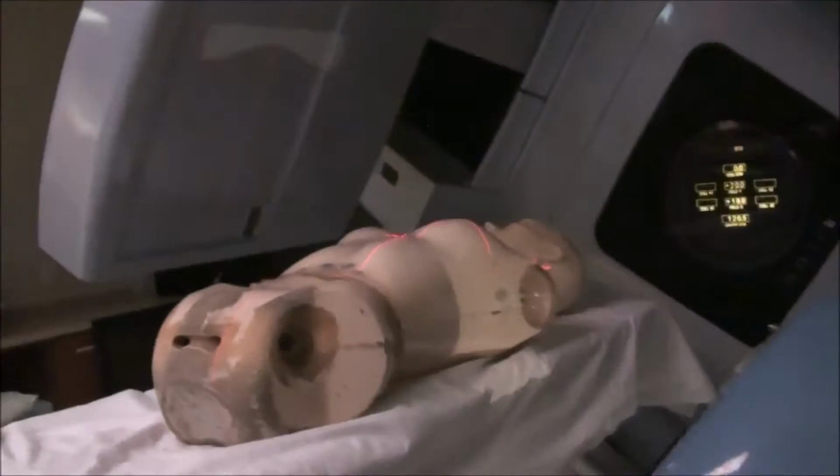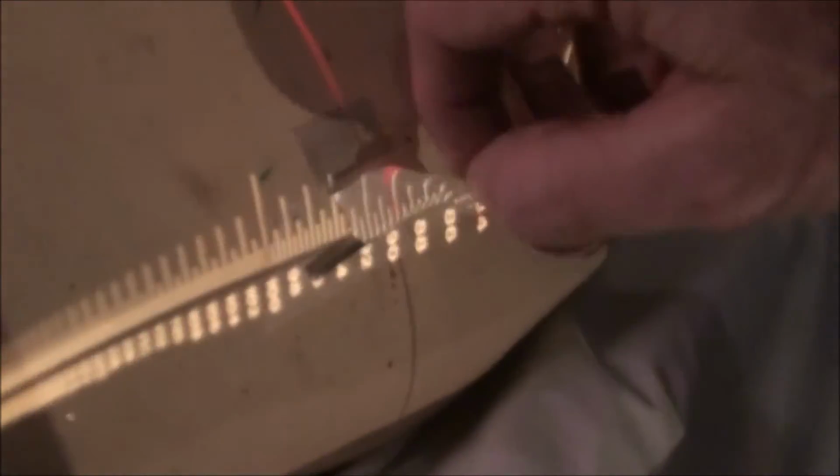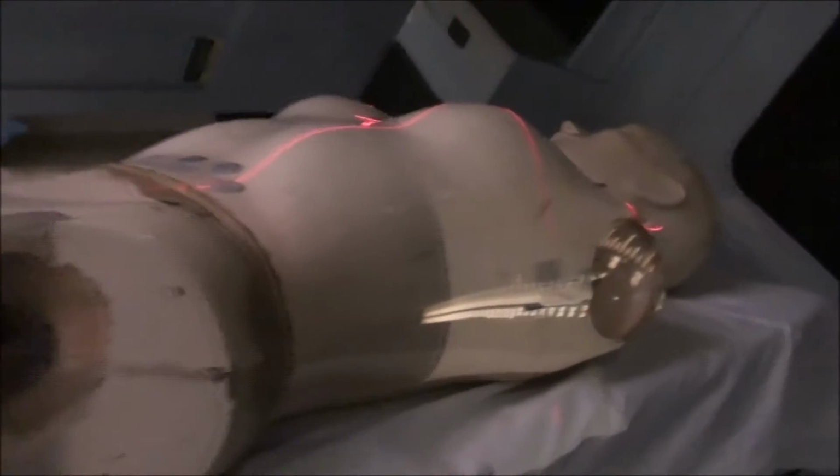We are now going to read our SSD right here. That's about 89.7. How do I know that? I know it from experience, but we're going to pull it. It's actually 90. Look at that. You're going to take the wire off. You're going to mark the CR and put your wire right back on. So we've got a CR, we've got an SSD. Take your other film.